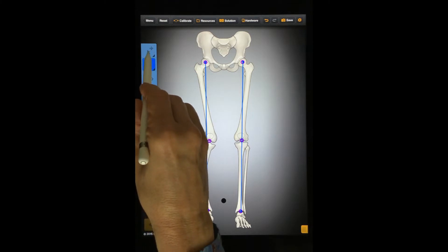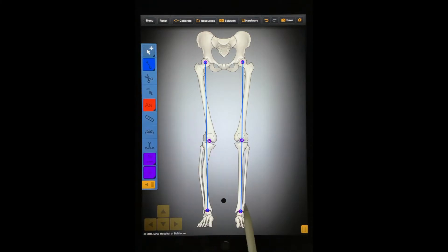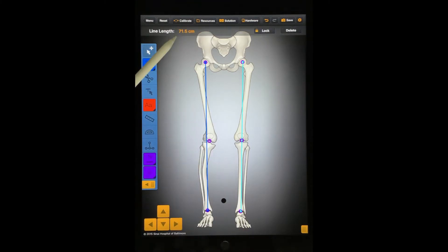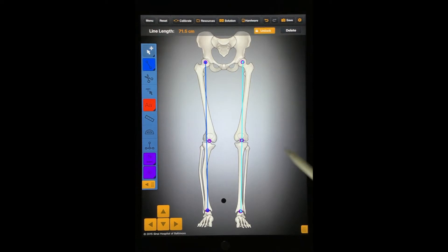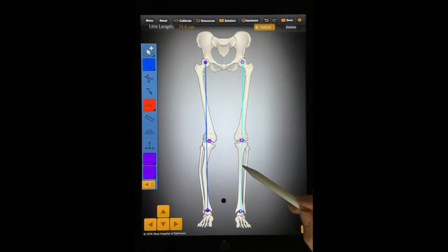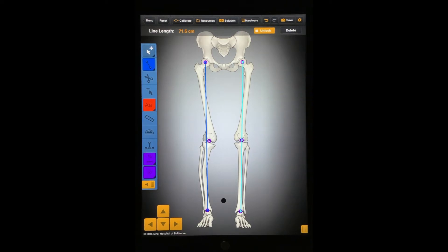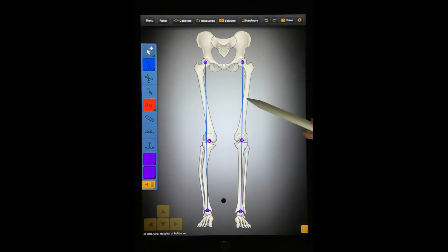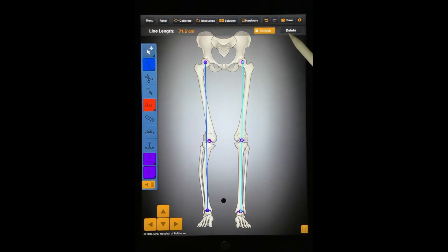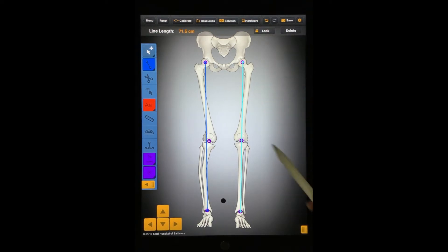When you use this tool to select a line, a menu bar will appear that shows you the line length. You can also lock that line so that it cannot be moved. If you lock a line and then wish to move it, use the Select Move tool to select the line and then press the Unlock button.